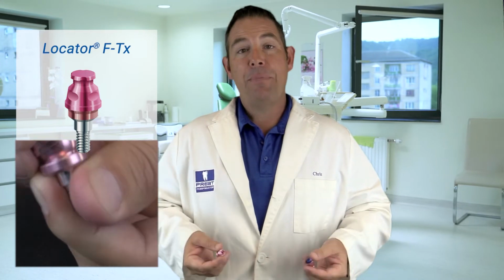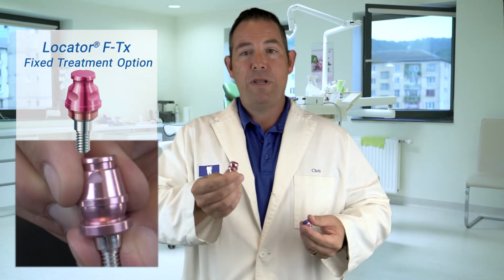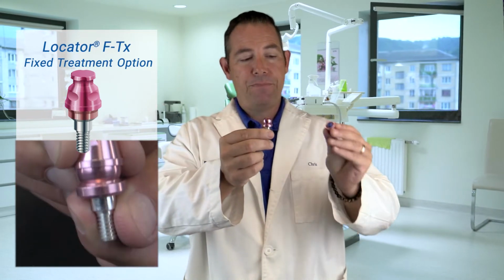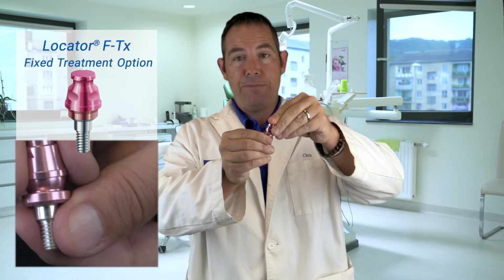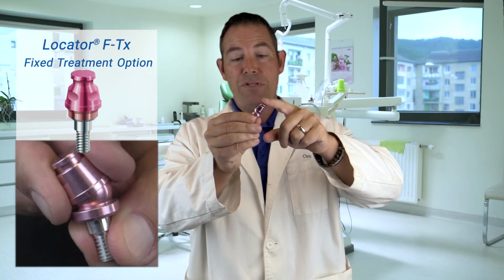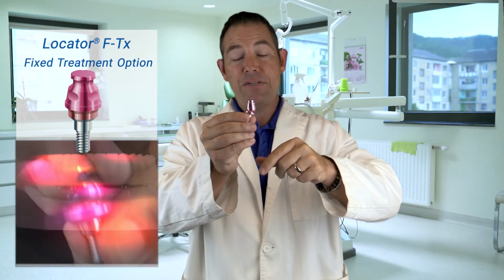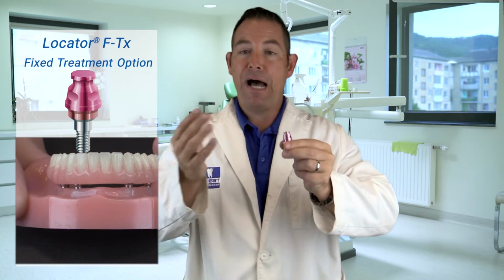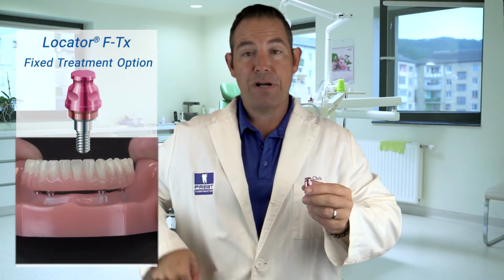Now the Locator FTX is probably where people get confused, because with the word Locator in there, you automatically think removable. But the FTX means fixed treatment option. The whole idea here is you have a spherical abutment, you have a ball inside of the housing, it snaps down, and before the prosthesis is engaged, you can self-align and pivot this.